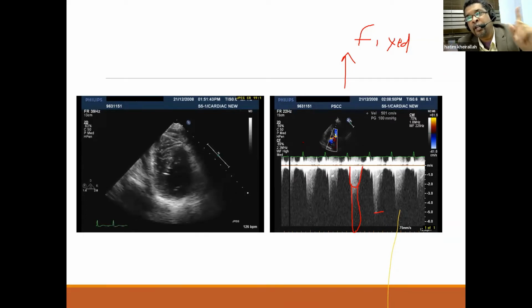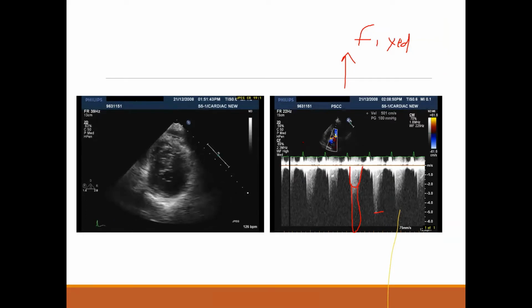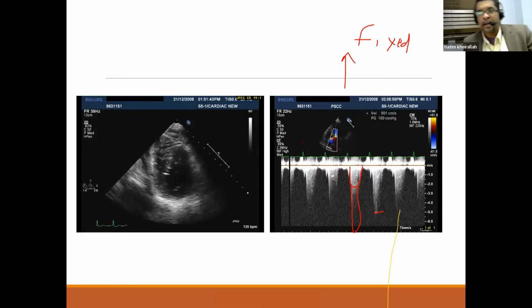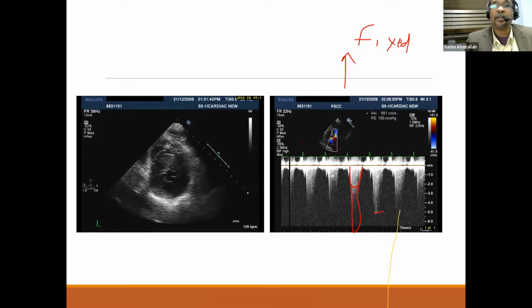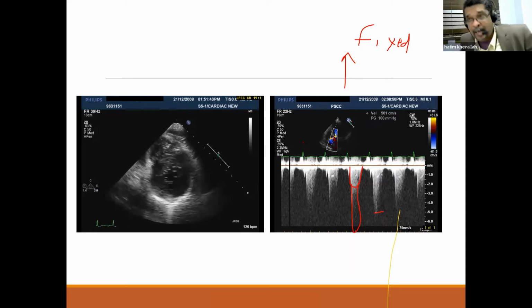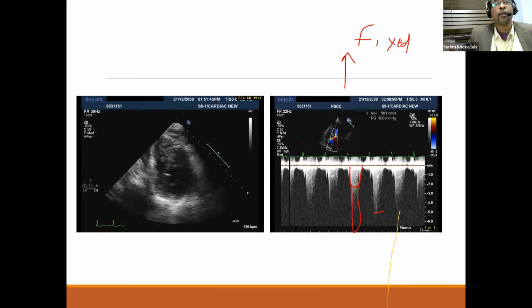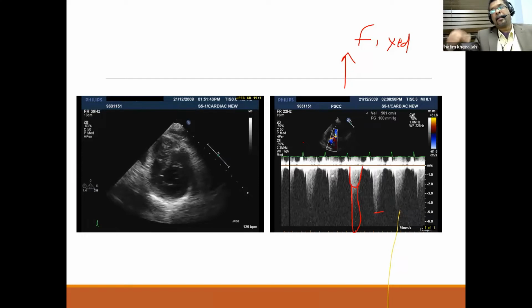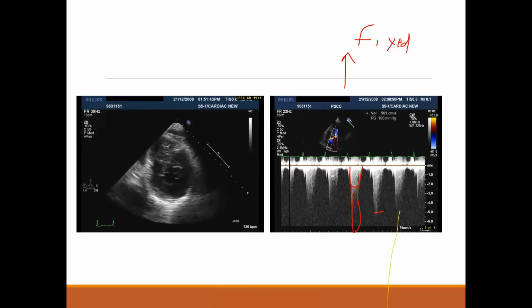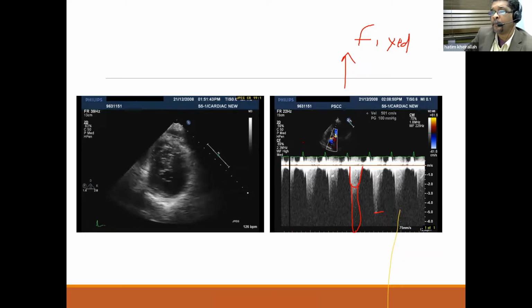One of the issues about aortic stenosis, if you have been asked, the most important cause of clinical and echo mismatch in aortic stenosis is measurement error. That's the most common, okay? The most common. And that's why you have to go back to echo, do echo again, okay, and try to make reconciliation. Time and effort is always fruitful, okay? That's important in aortic stenosis as in all aspects of echo.